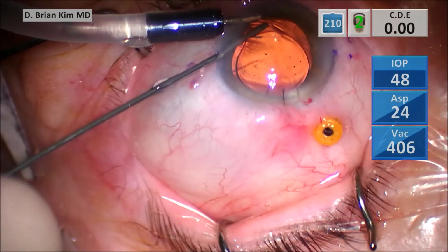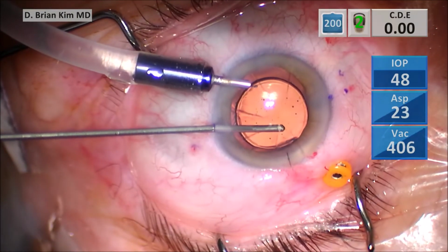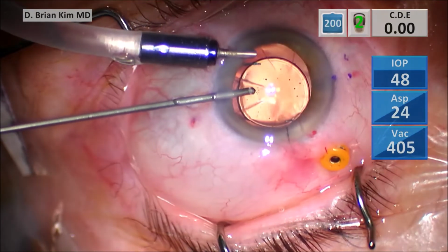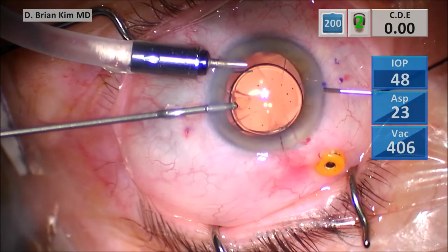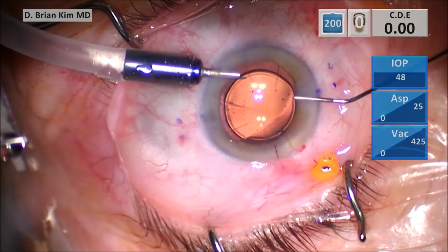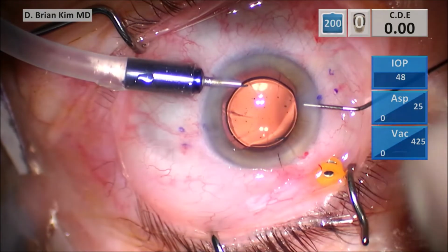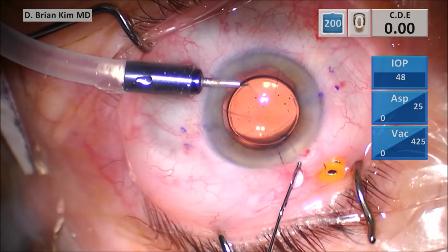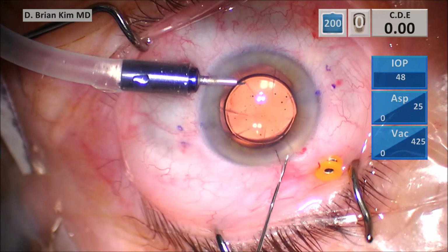And therefore, I have to remove that viscoelastic that's now in the anterior segment. And I like to use the vitrector in cortex mode because all it is just I/A. The infusion is through the Ogawa AC maintainer, 22 gauge AC maintainer, and the aspiration is through the vitrector. Push BSS in as I withdraw the vitrector.